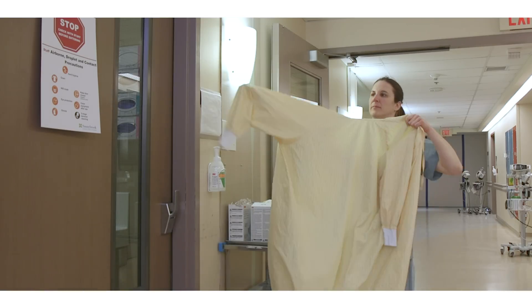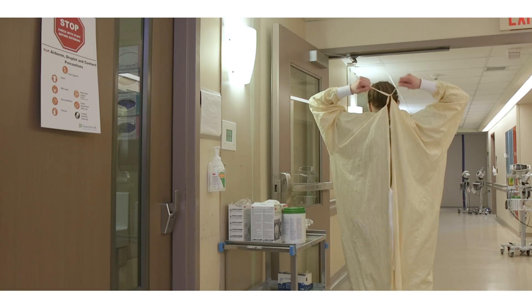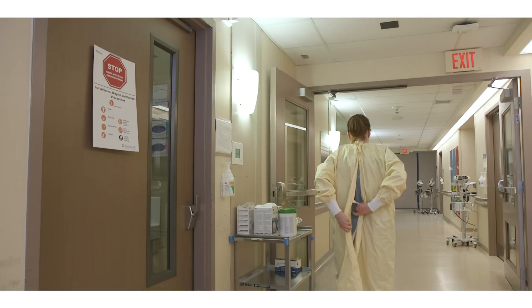Ensure you are clean shaven, then don your gown. Tie around the neck and around the waist. Secure the gown using a bow that can easily be untied. Ensure all clothing is covered by the gown.